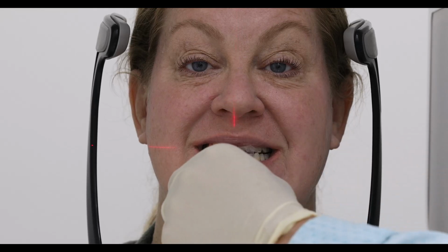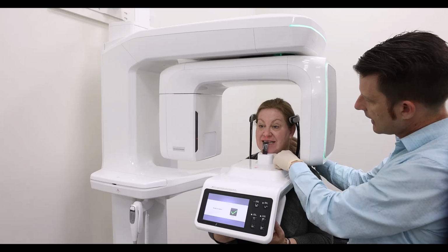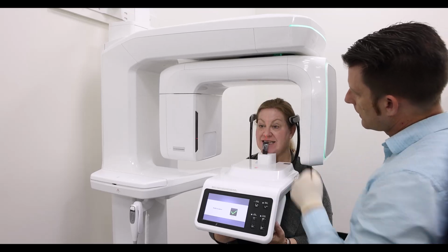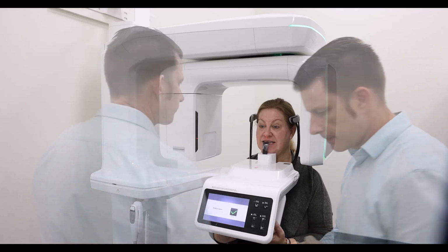I want to ensure their chin is firm on the chin rest, so I'm going to gently push down on the bite stick, and now the patient's chin is firmly on the chin rest. The next thing to check is our mid-sagittal beam. We want to ensure that the patient is centered in the device.